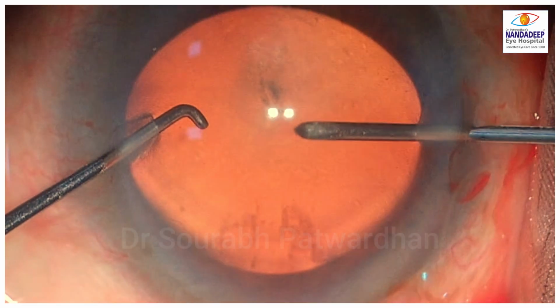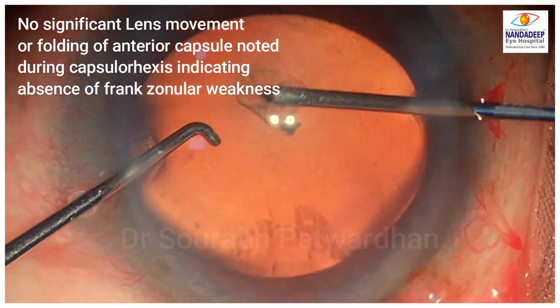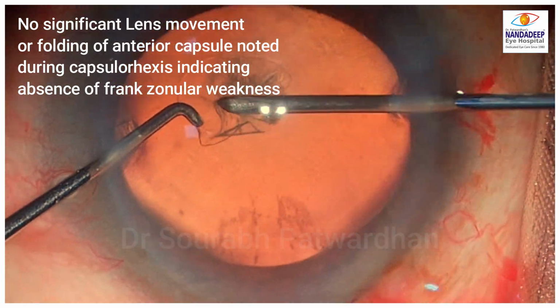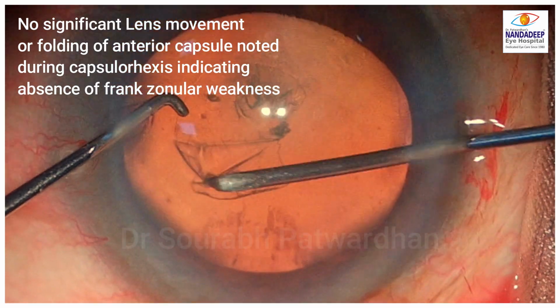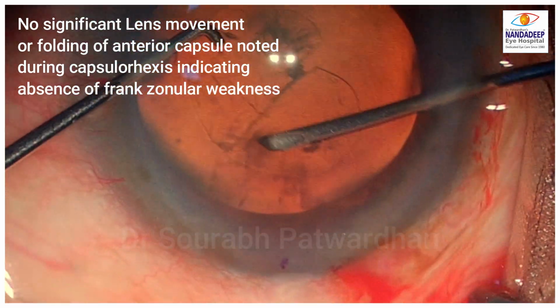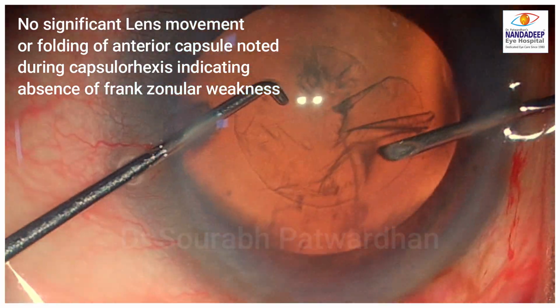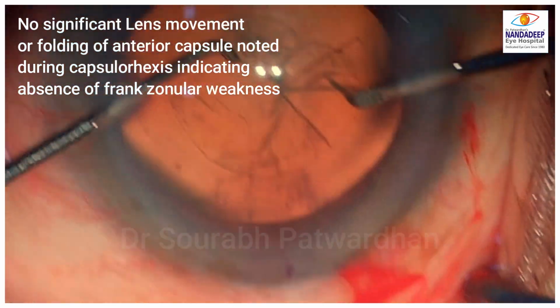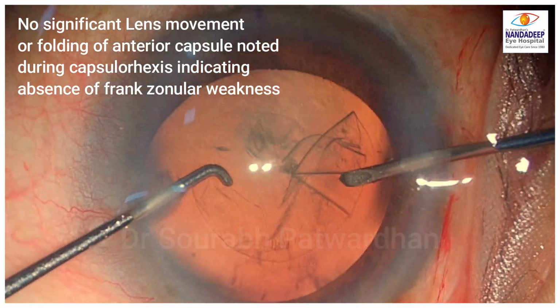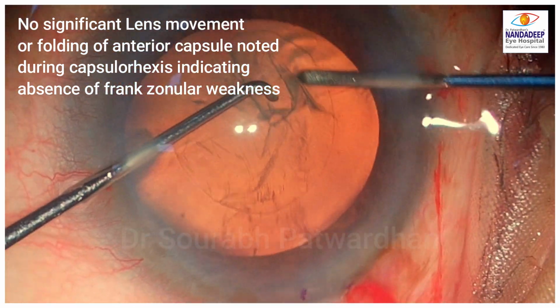To begin with, you can see the capsulorhexis appears to be going on well. No significant lens movement again, indicating no diffuse zonulopathy. Some amount of folding of the anterior capsule, but again not very severe, and there is no frank zonular weakness in this case as well.